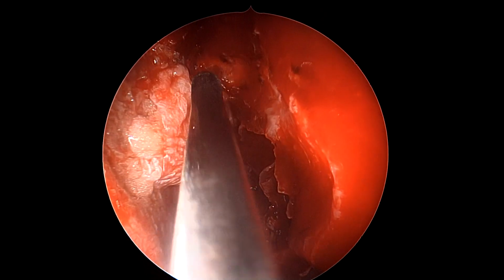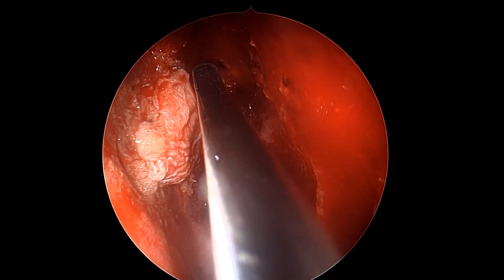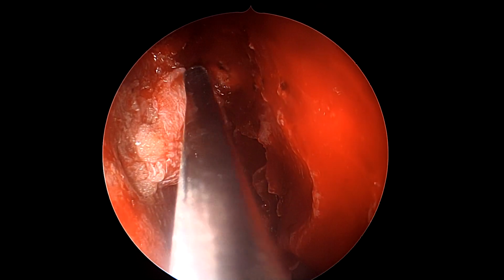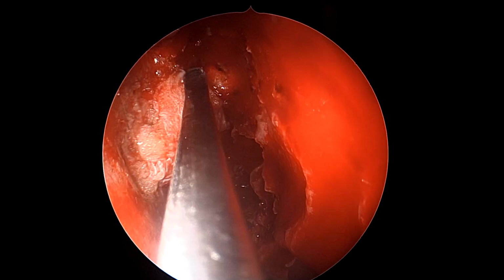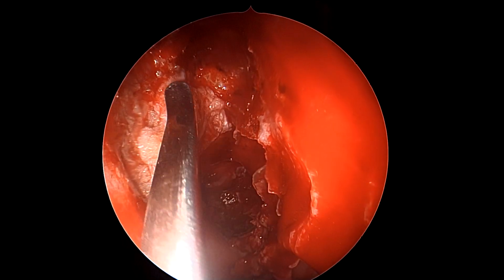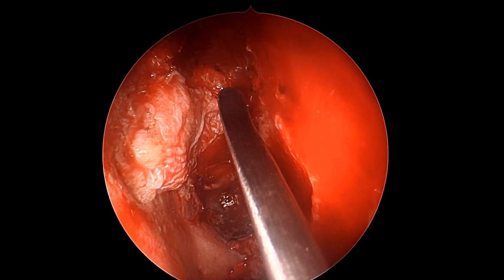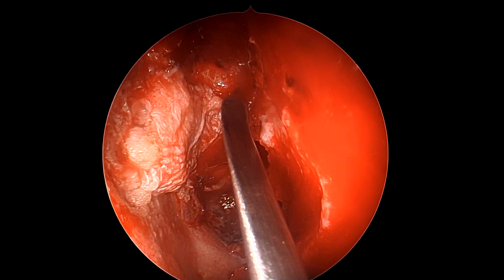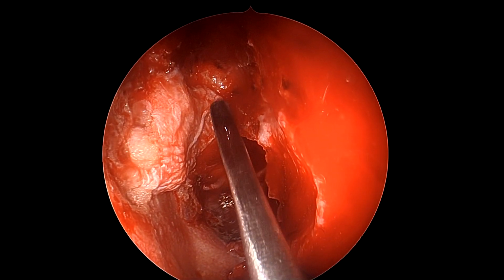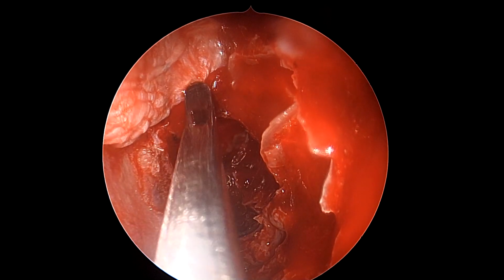And on top of this, we have used a fascia graft, a small fascia graft, again not a very big one. Important is to see that it should be having contact with the bare bone on all sides and not mucosa, because if it is kept on the mucosa, it will not take up. So the fascia must be covering the fat, and it must be in contact with the bone all around and must not be turned onto itself, because then there is a higher chance of the graft not being taken up.